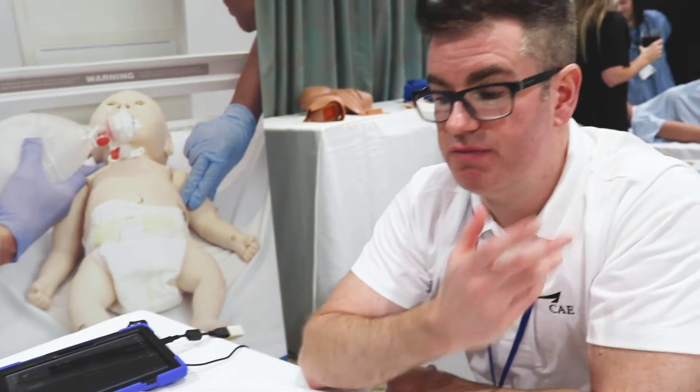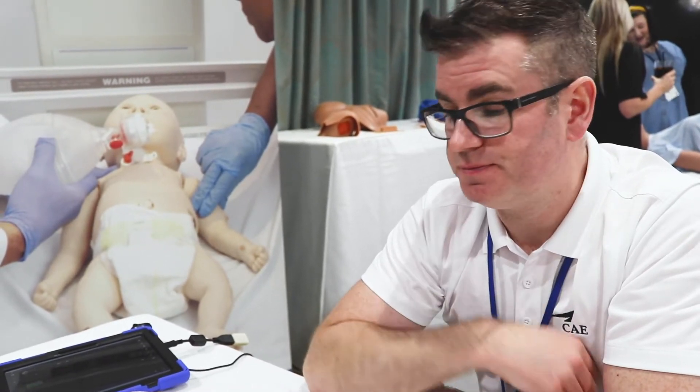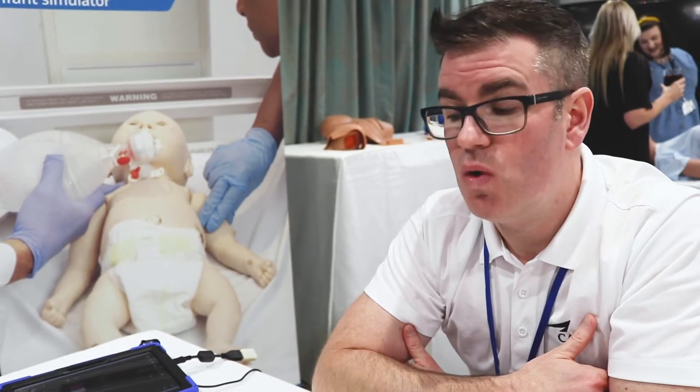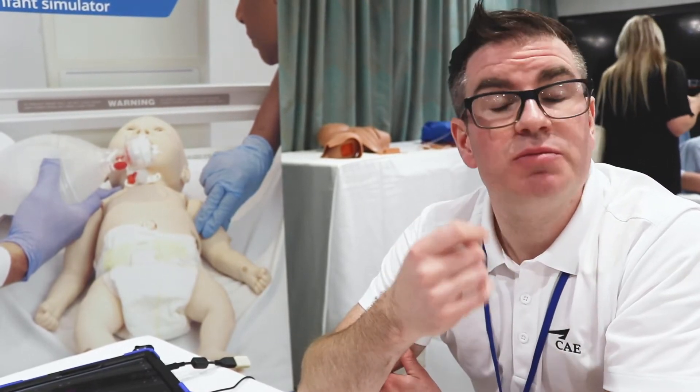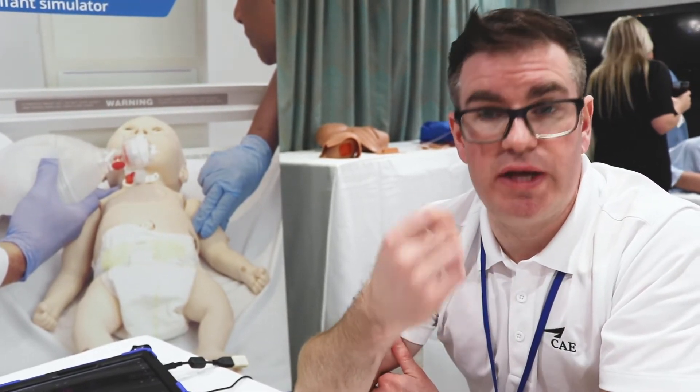Luna has an advanced airway so we can intubate with an ET tube, LMA, or iGel. We can perform right main stem intubation on Luna, or intubate incorrectly and distend the stomach. Luna is also going to have a ventilator-compliant airway, so she will be able to sit on a ventilator and you can change the compliance and resistance. Luna also has a tracheostomy site on board so we can practice placement, cleaning, removal, and so on.